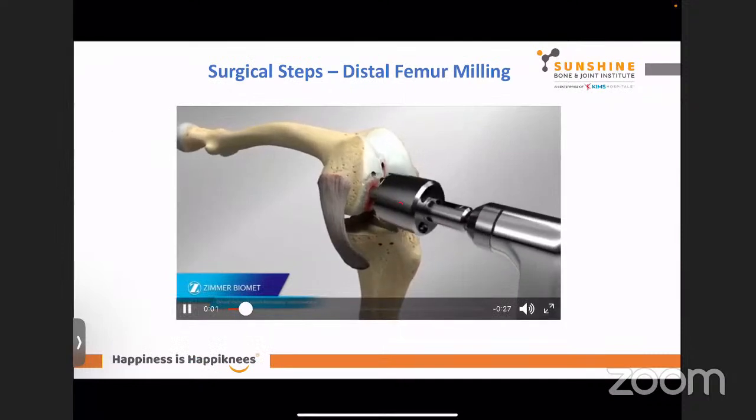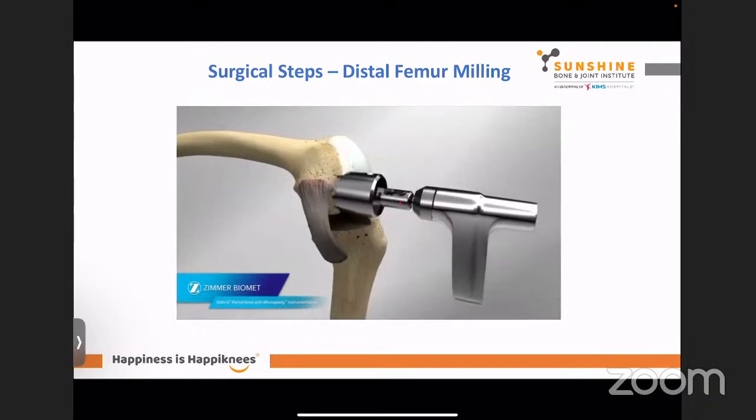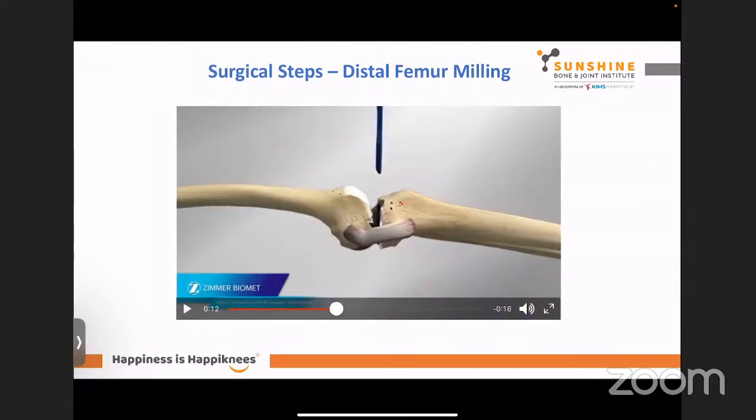Let's start this from the beginning. Your distal mill is done. This is the zero spigot. It's a zero station mill. So you created a minimum extension gap. You put in your trial implant. You put your joint into flexion. So this is a four size femur. Four size feeler gauge. You put it in flexion because your cut was 4 with the 4 G clamp. So your femur flexion size is 4. Then you check your extension gap by extending it and checking with the 1 spoon. So even the 1 spoon is not going in. So that's a 0 gap in extension.